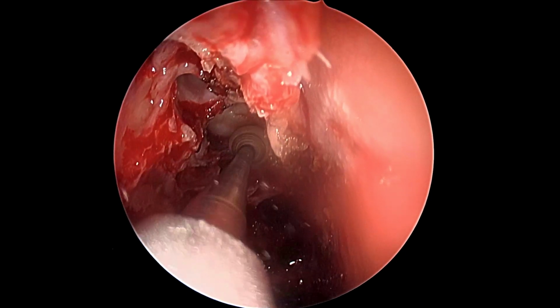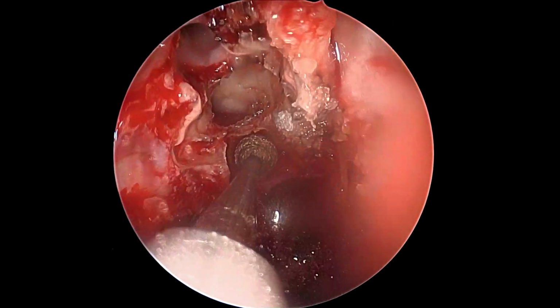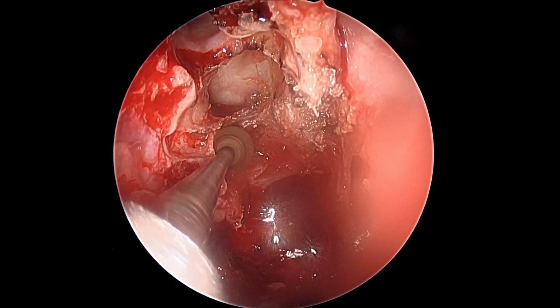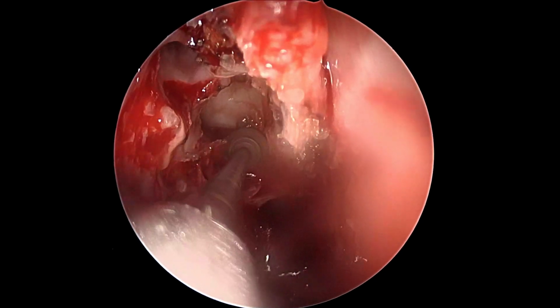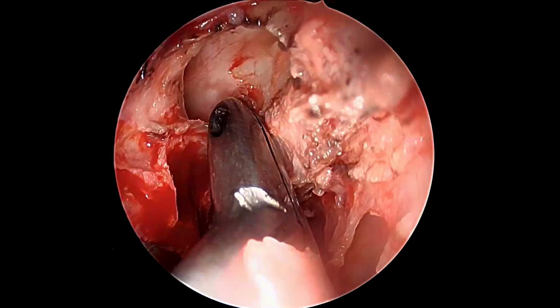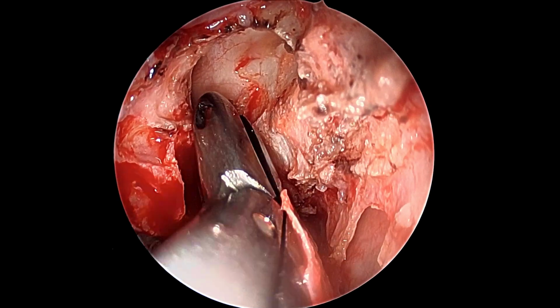So we use here a normal diamond burr. We do not advocate a coarse diamond or a cutting burr here. It is normally just a very flat and simple diamond we use for mastoid saucerization. And as we can see here, we take our time slowly to flatten the bone and try to reduce the ridges as much as possible, because that would be the most optimal for graft placement and uptake.